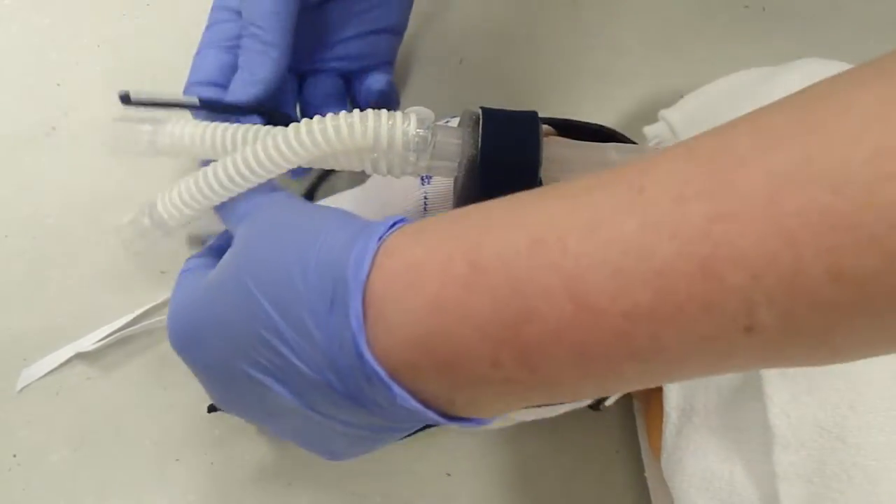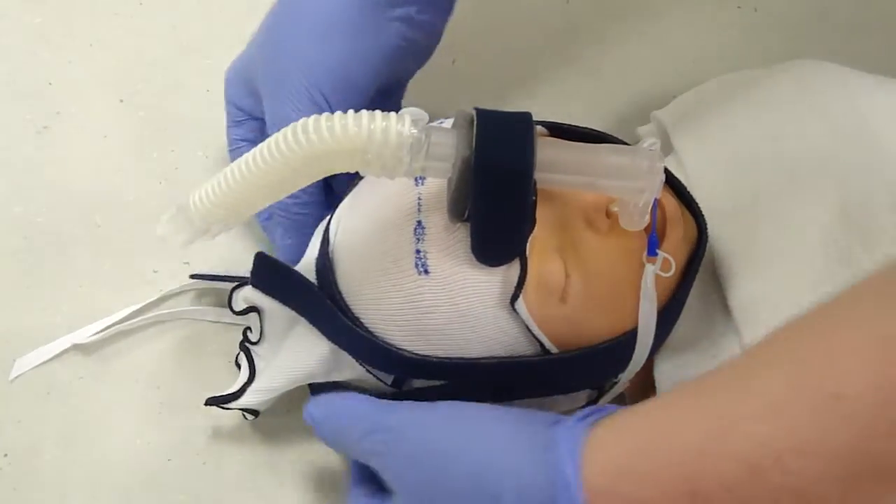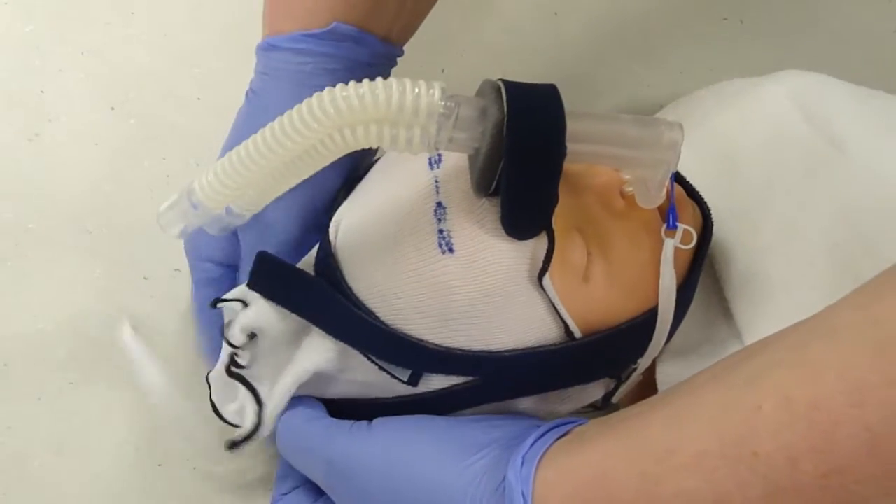One strap is going to come across the top of the head and secure. The second strap goes towards the back of the head and Velcros in place.